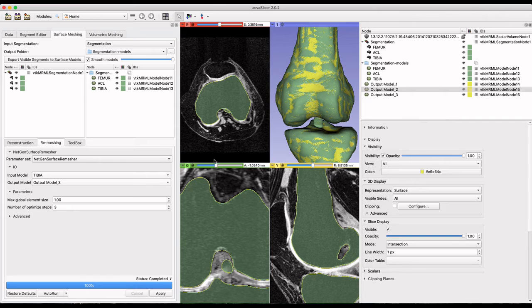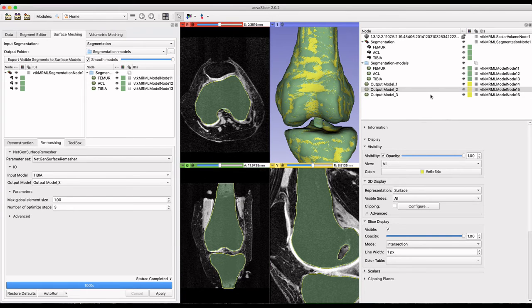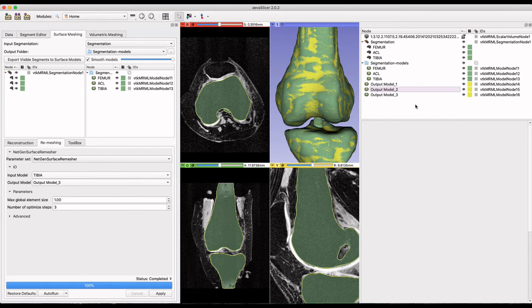Scrolling through the volume slices with the new mesh and original segmentations is helpful to make sure that not too much of the surface was lost during the smoothing process.